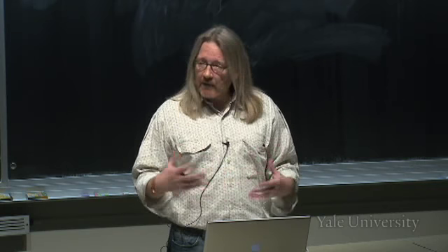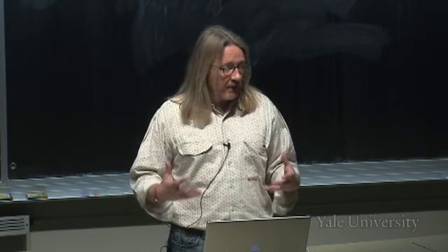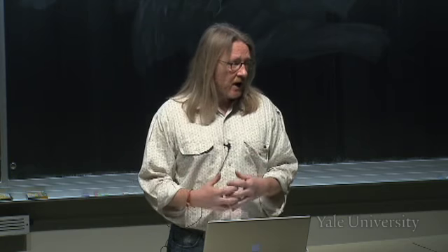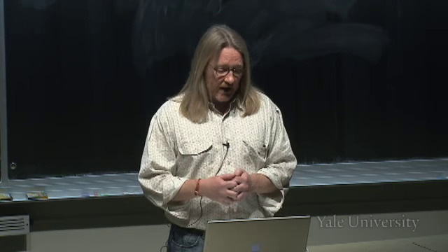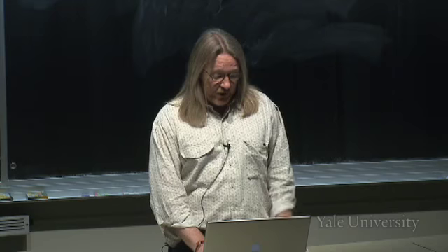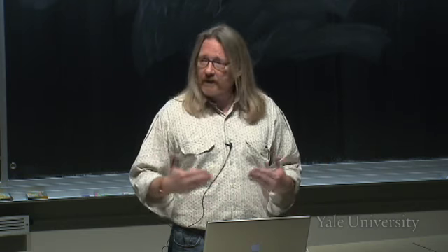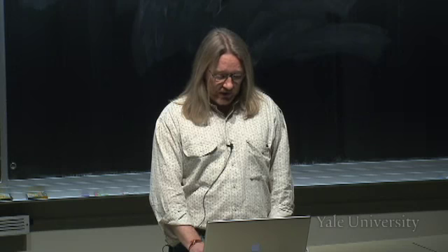What I want to talk about with MR is a different way of forming images that uses a different kind of physics, and so the elements of intrinsic contrast are different. We'll talk about what makes MR images in a few moments. But bone does not appear well on MR images, whereas bone appeared very well in X-rays and CTs, for example.